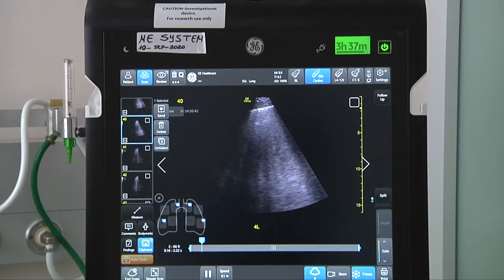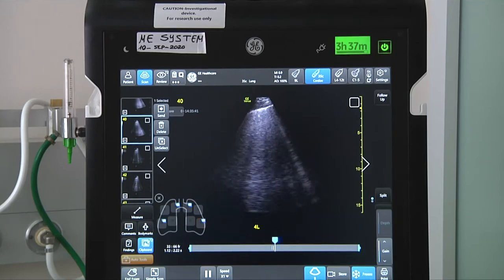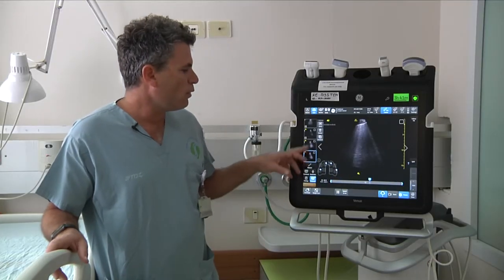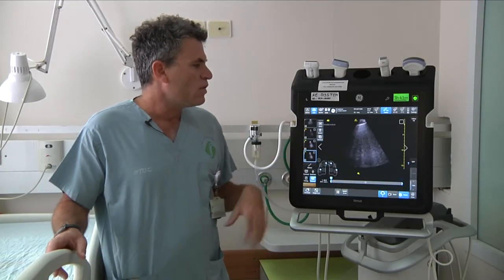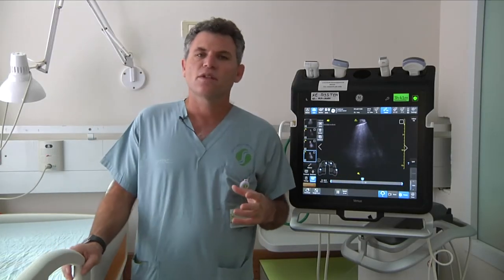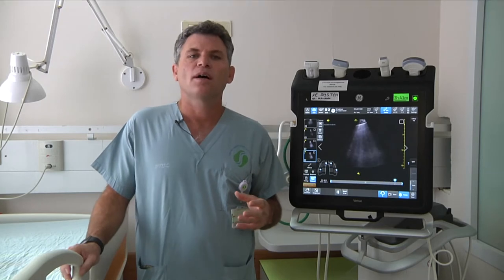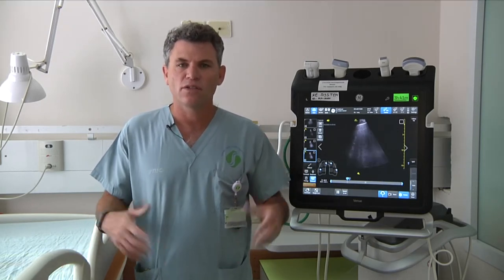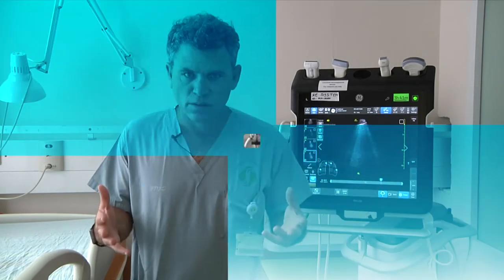The lung ultrasound mode here is also very helpful because the presets are very helpful in enhancing the B-lines.